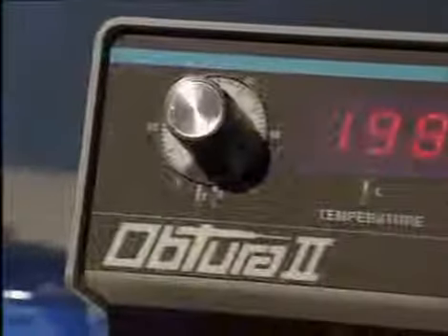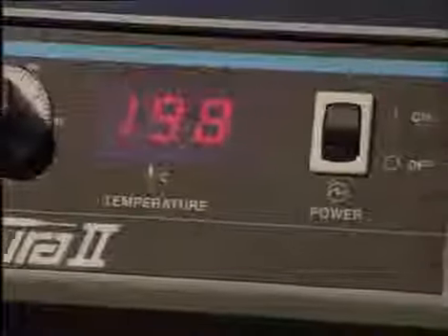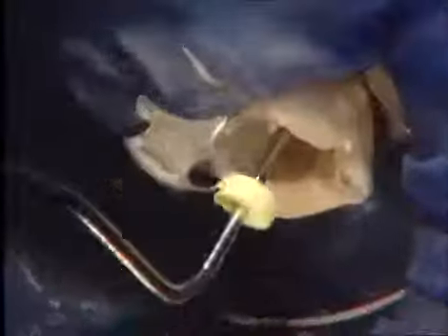Afterwards, the root canal system is filled step by step from apical to coronal with gutta-percha. The best proven system for this technique is the Obtura II gutta-percha gun. With this system, you can apply and condense thermoplastic substances in short portions. The hot, pre-curved needle is inserted into the canal until it comes into contact with previously packed gutta-percha apically. Pluggers are used for compaction.